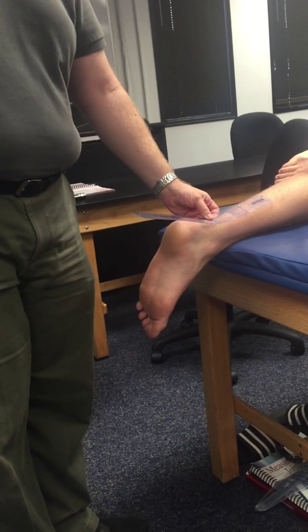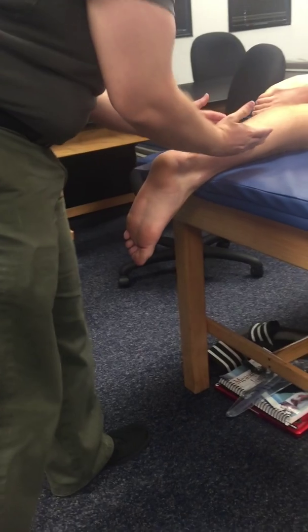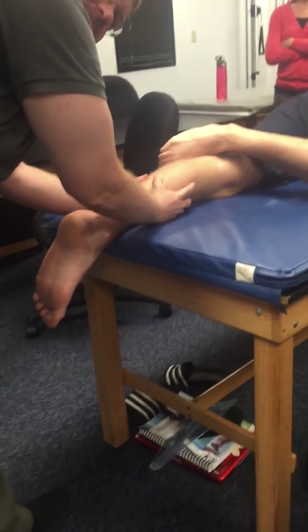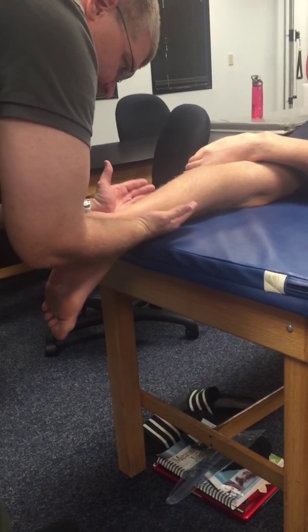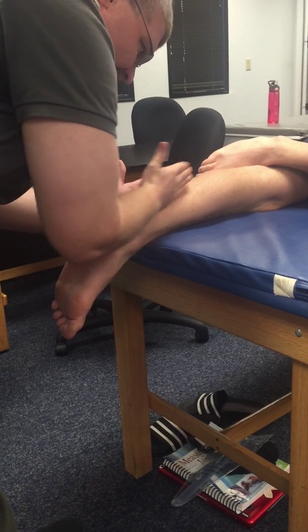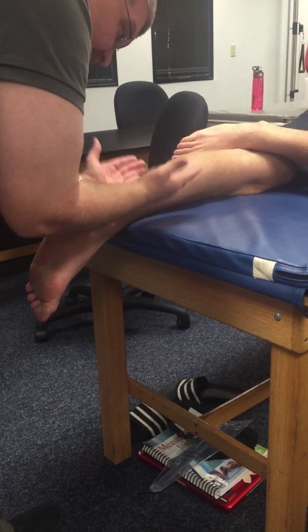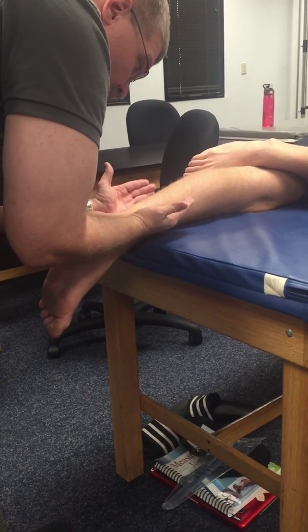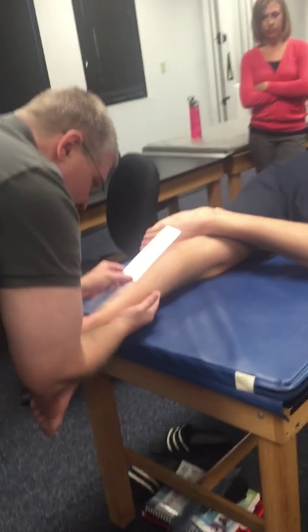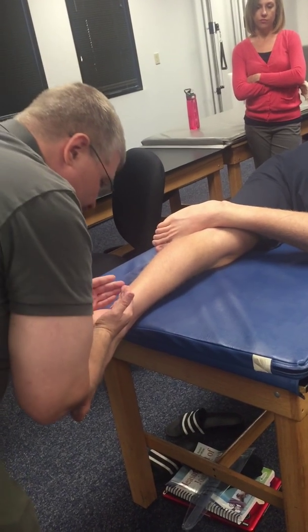That is going to be where your axis goes. For the proximal arm — the stationary arm — try not to get caught up in the gastrocs. Look at the posterior lower leg and try to imagine where the very center of that is. I sometimes frame it with my hands to really tune into where the exact center is, and once I've identified that line I can mark it with a marker.